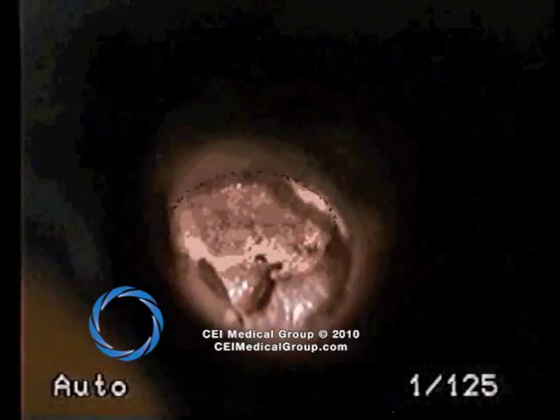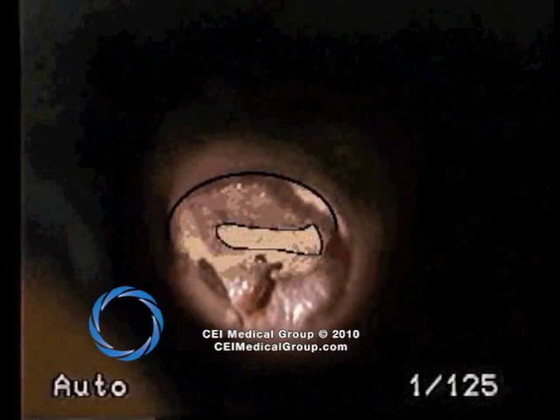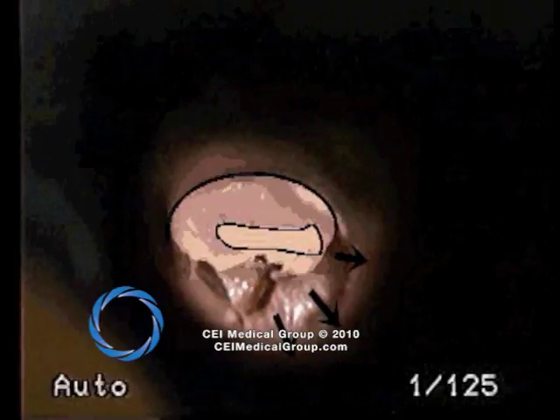This is the microscopic view with the malleus and the facial ridge being demonstrated. The anterior sulcus of the tympanic membrane is highlighted in black. The malleus and the remnant tympanic membrane are visible, and the mastoid bowl is around the corner, which will be much more easy to see in a few moments.